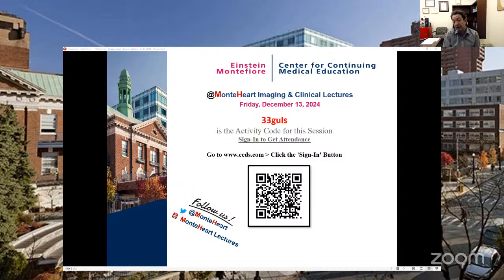If you want to look for plaque for risk assessment, CT is the only non-invasive modality to do it. If you're looking to explain symptoms, probably the functional test is comparable to CT. If you're looking for prognostic information, then they seem to be somewhat comparable for the presence of ischemia or the higher risk, but on the lower end, seeing plaque is better. So probably you need plaque to start with, and then you can add the functional or the obstructive information from the CT as an add-on. But I think it's very hard to explain it all because we don't know the name of the disease and the definition of the disease that clearly. That's my understanding of the problem.